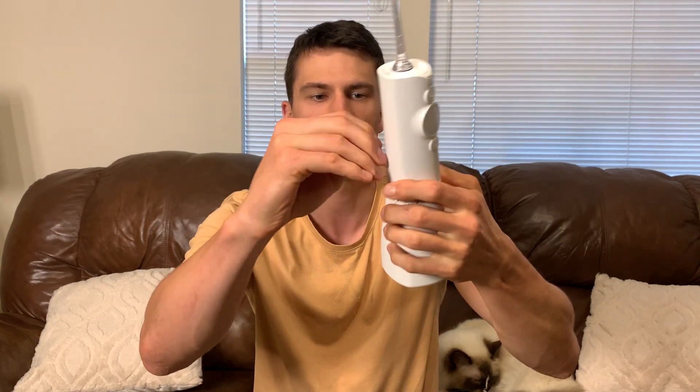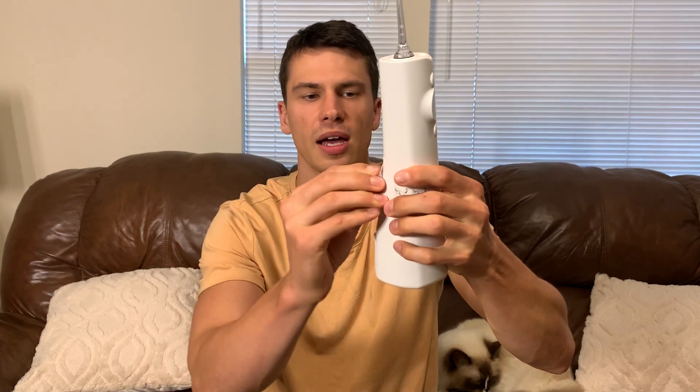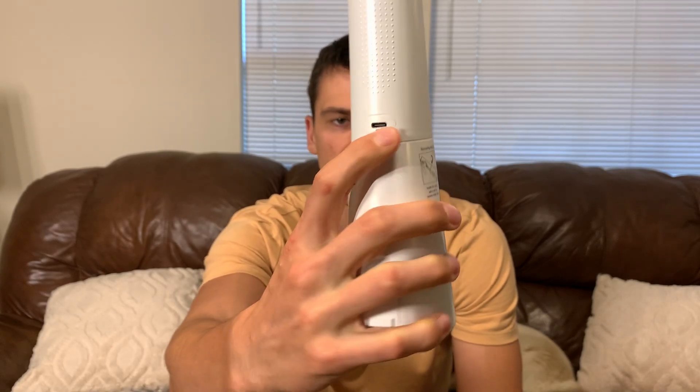This is where you're going to put the water in, and it has a little seal. I was a little concerned — is this going to drip water? It does not. You can twist it right here and this opens up the reservoir itself. It charges via USB-C in the back, which is awesome. So many things take USB-C these days, which makes it really easy to keep this thing charged.